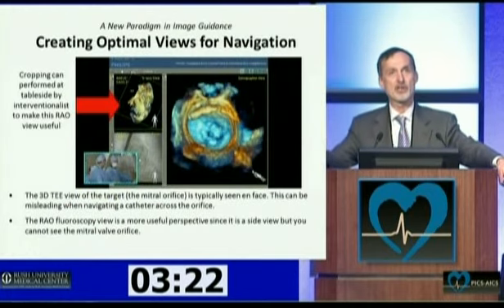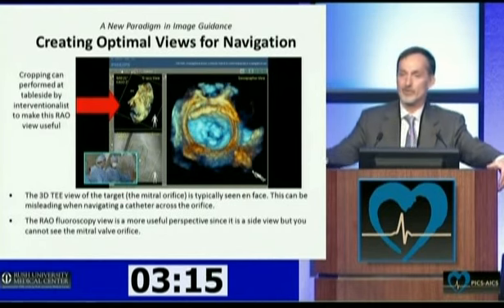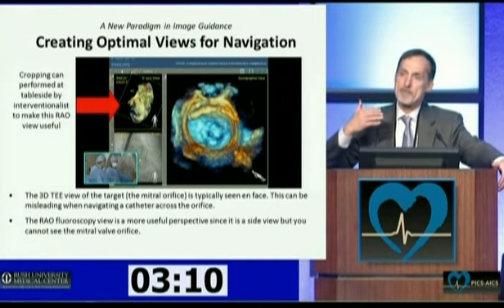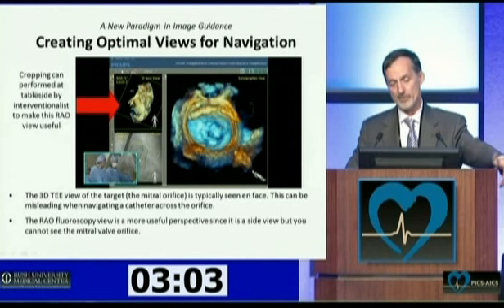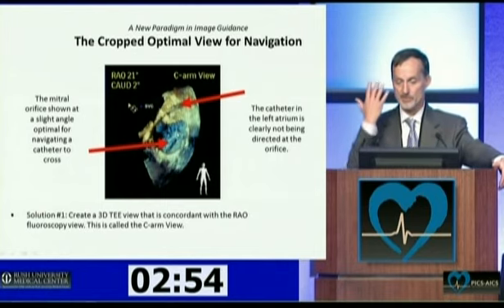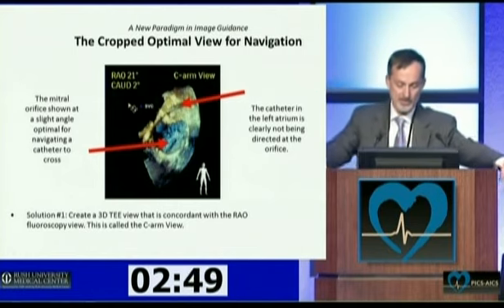And you can start thinking about creating optimal views for navigation that heretofore were not under your control. You had to communicate with the echocardiographer, but often it was more difficult to communicate exactly what you wanted. And here we had a side view of a mitral valve, and we wanted to crop it. And this is a view where it's cropped away. So you see this orifice of a mitral stenosis patient. We've cropped away this blocking component of the 3D ultrasound digital data set.